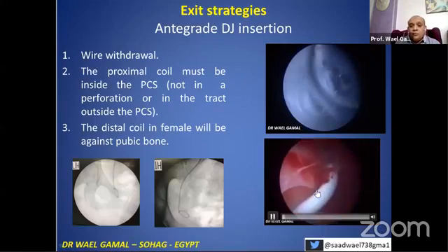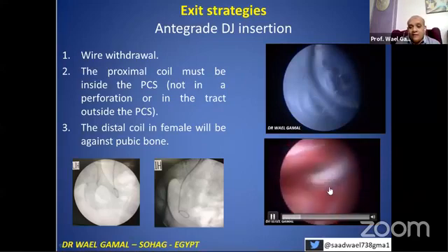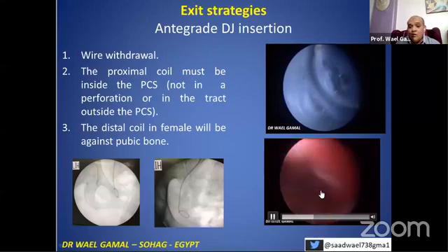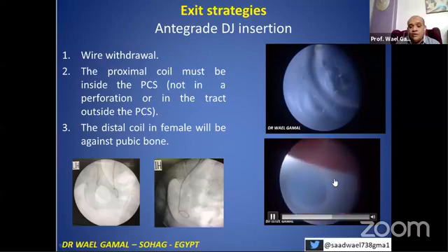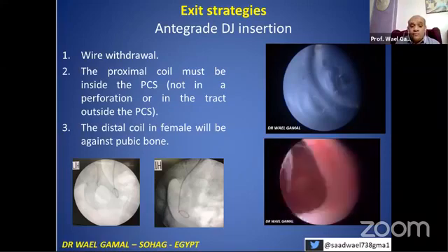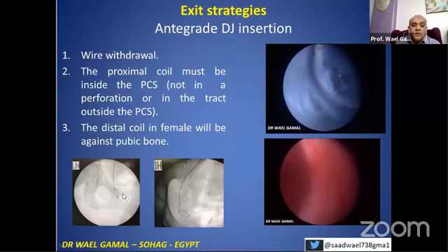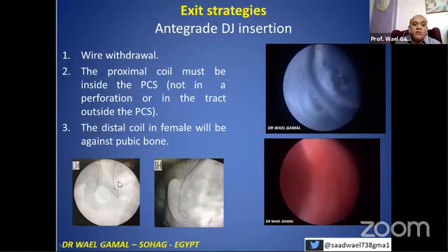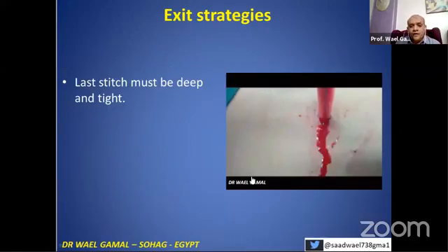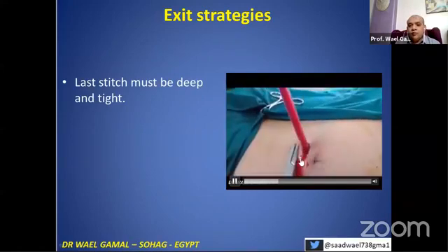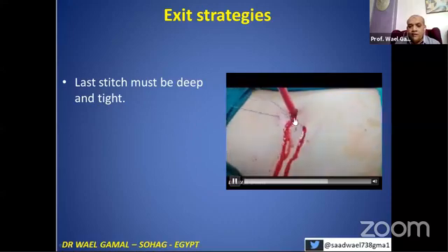Be sure that the proximal coil of the double-J is inside the pelvicalyceal system — the double-J is outside here, this is the kidney capsule from outside. Take it with your forceps and ensure the proximal coil is inside the pelvicalyceal system, not outside. Otherwise there will be leakage and the patient may present with perinephric abscess. Second important point: when you relocate the proximal coil, be sure about the distal coil — it differs between man and woman. In a woman, it will be against the symphysis pubis; in a man, it will be differently positioned. If you don't keep this in mind in females, there will be more withdrawal from above and it will shift into the ureter, requiring relocation again. The last stitch — you have to do it yourself, done very deep to control any bleeding from the skin and subcutaneous tissue.